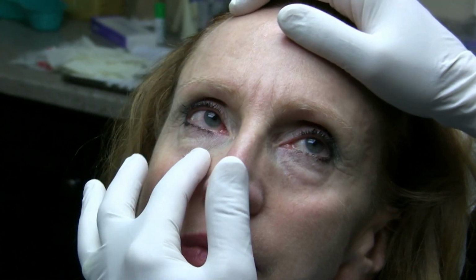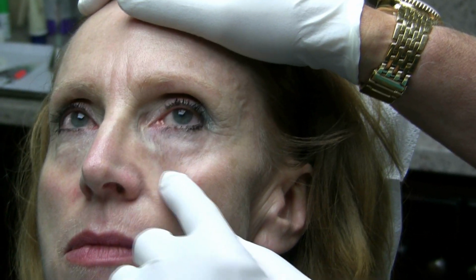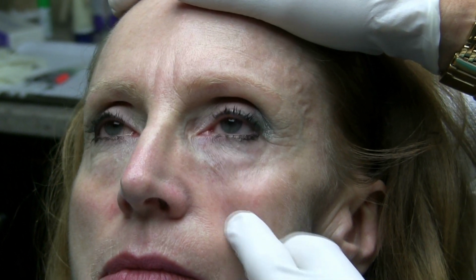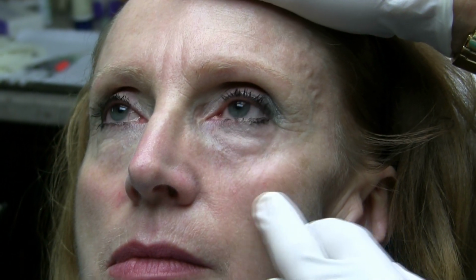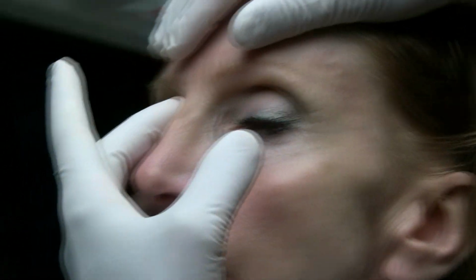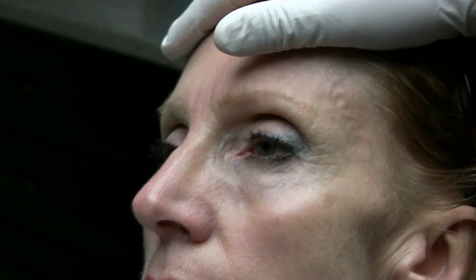She also has atrophy in the infraorbital region and in the tear trough region, and some submalar or infraorbital atrophy as well. And so, just by displacing some tissue there, you can see how that improves the situation. And she has a little bit of a dorsal hump, which she would be a good candidate for some filler rhinoplasty. So step A is to do our marking and anesthesia, and then we'll do our actual filler.